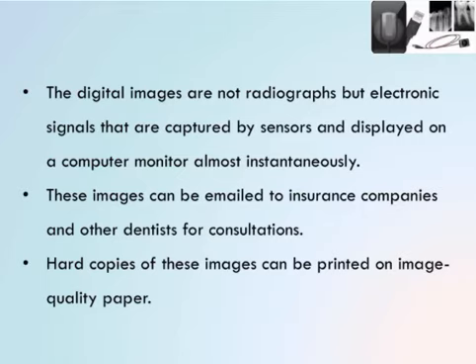Hard copies can also be printed, or it can be copied to a compact disc or a flash drive. This enables better recording of the images.